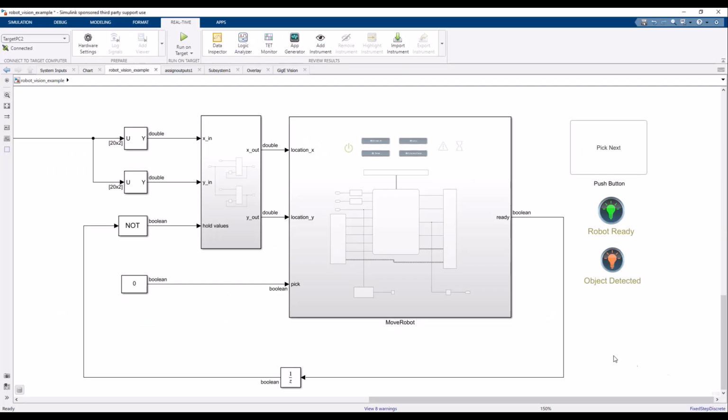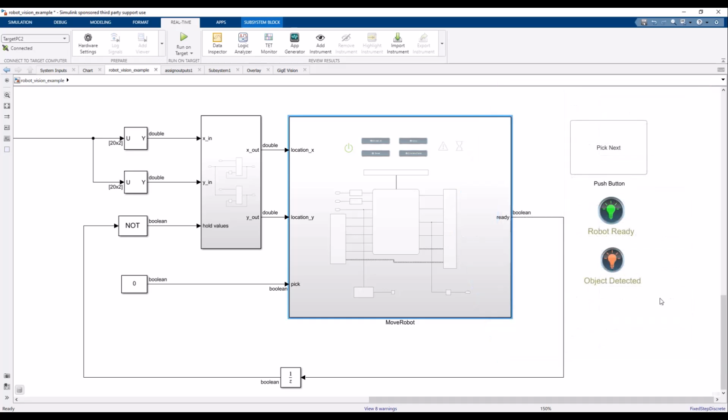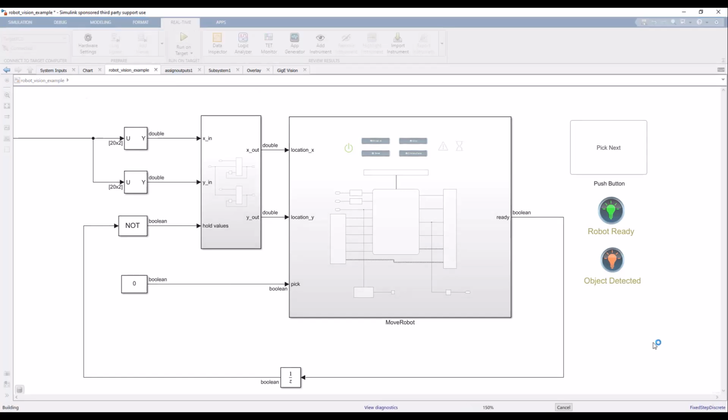The object detections are then fed into the supervisory controller for the robot arm as planar XY coordinates. The move commands generated by the controller are sent to the robot using EtherCAT transmit blocks from the Speedgoat I/O block set. I have also added 2 dashboard indicators to observe the state of the system and a trigger button. I am already connected to the Simulink real-time target machine, as we can see in the top left corner. So I just click run on target and the model is compiled, loaded and executed on the target.